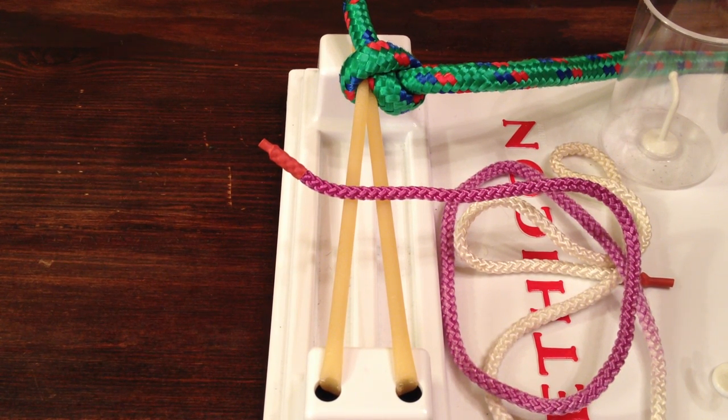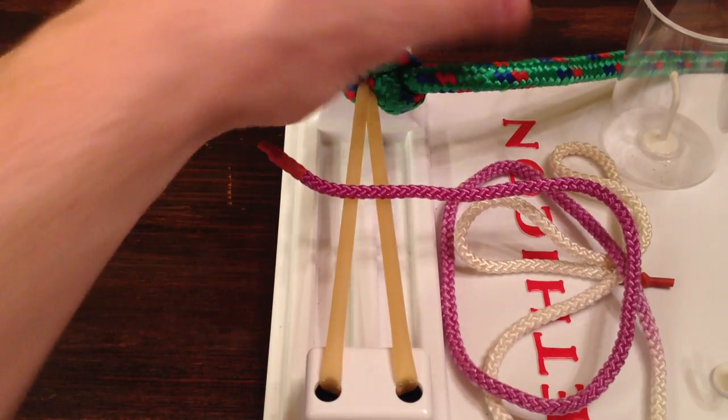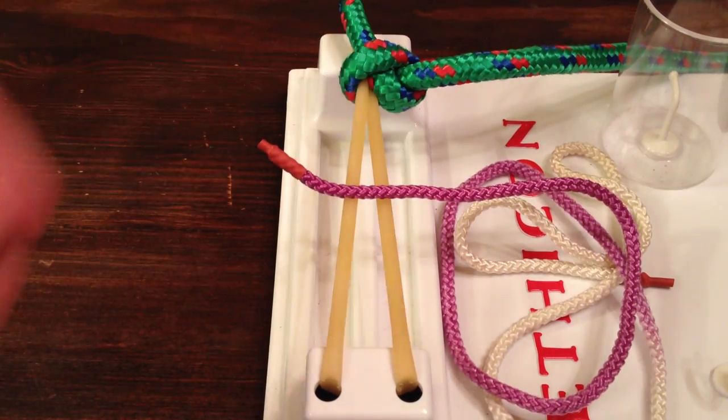How are you going? This is Dr. Amadary, and today I'm going to be teaching you how to tie a drain stitch. Let me just orient you real quick. This is going to be the skin here, and this green string is going to be our drain.